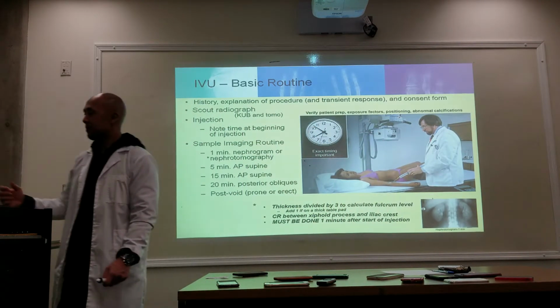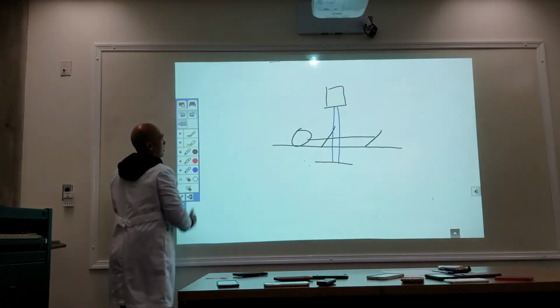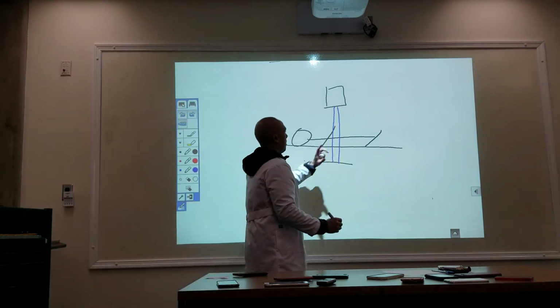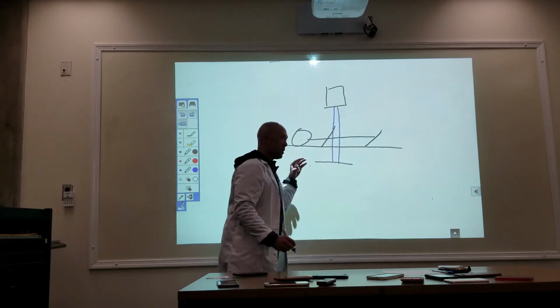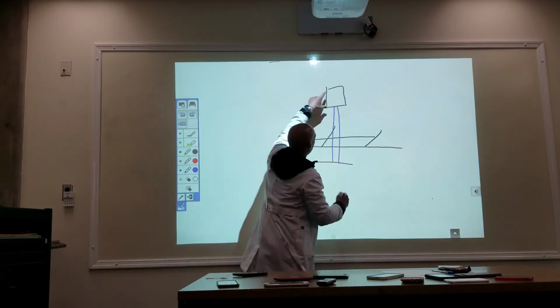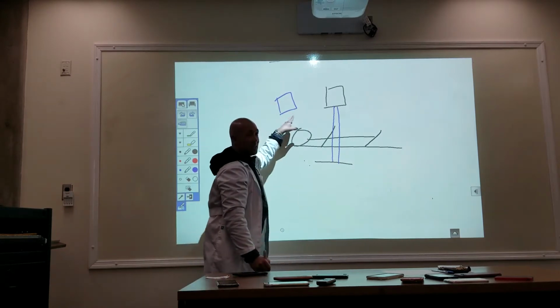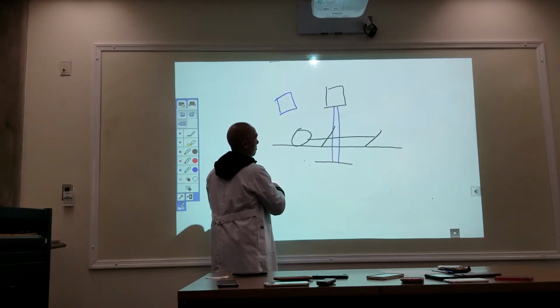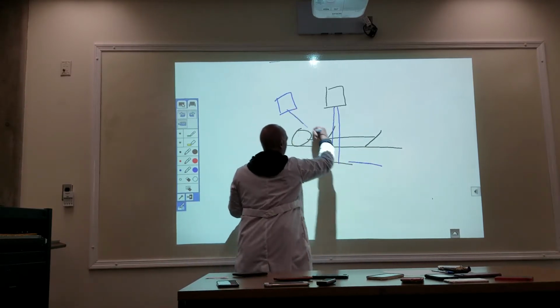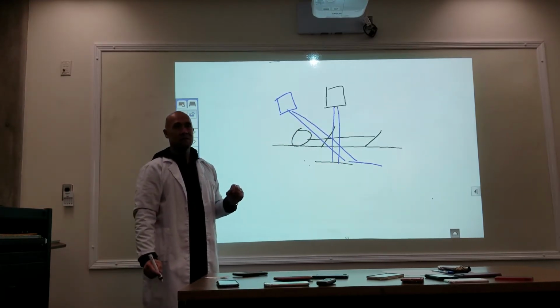So we're going to engage this tube to the Bucky underneath. All right? So what a tomogram is, we're going to put the X-ray tube in what we call zero position. So that means that this tube is going to be over here. And because it's connected, where do you think the Bucky is going to be? The Bucky is going to be over here now because they are connected. You guys follow?